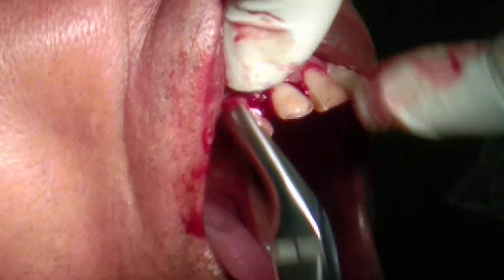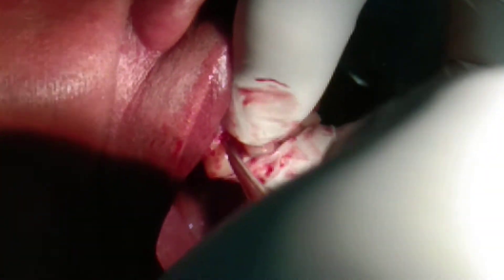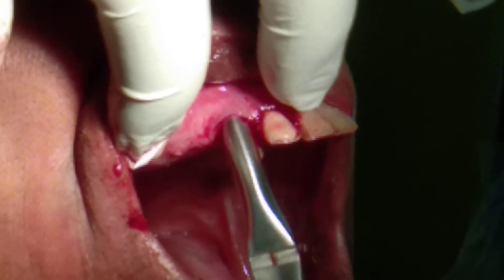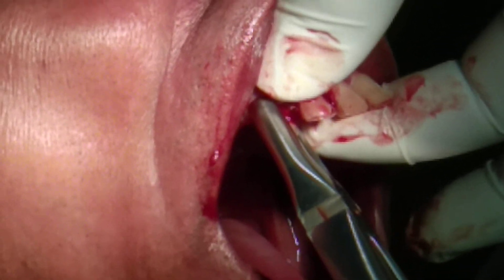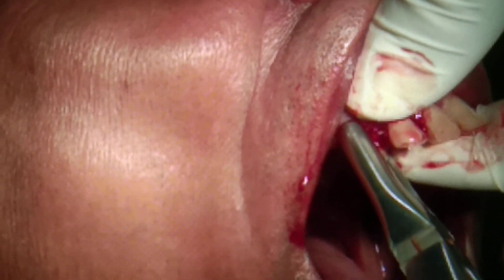If you think you need more luxation, I am going to luxate this one also — both of these. First force is always apical force, and then I am using an anterior force. See, now the tooth is getting luxated.